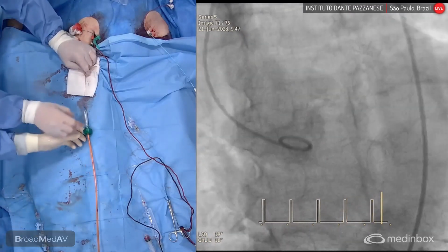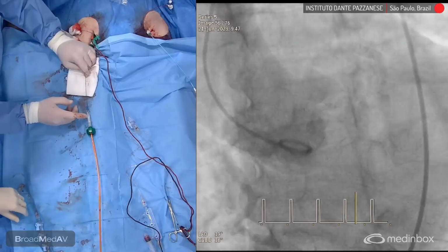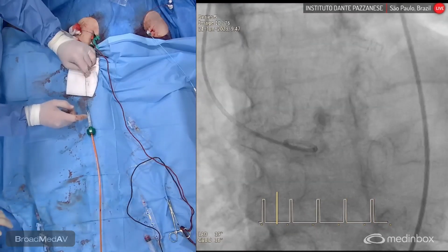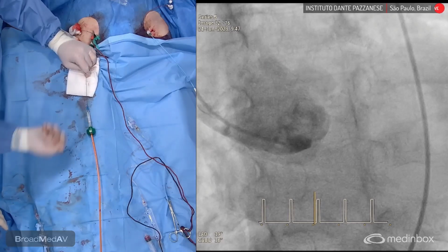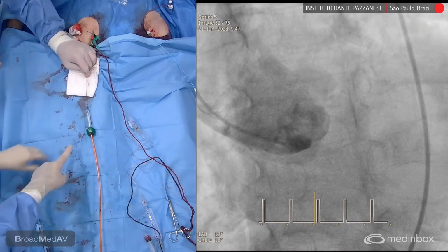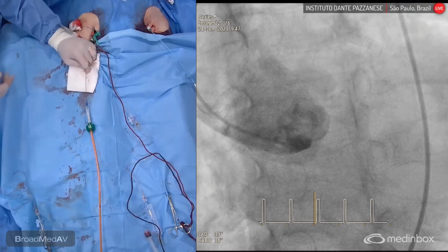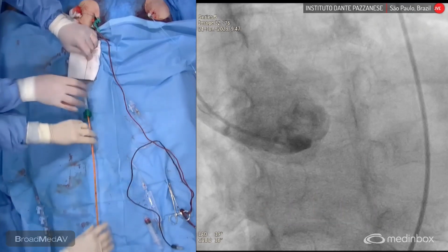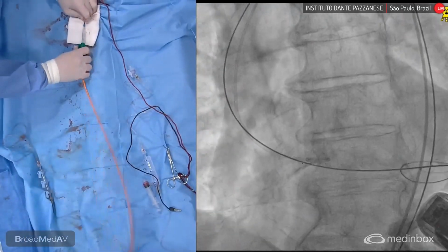Let's go to the procedure. It's also important to check the valve orientation. We have the external PET skirt directed in the distal part, and the open cells region in the proximal part. Can you zoom in on this, please? Thank you. So it's aortic position. I think we can move on. We already checked the volume on the deflator. Thank you.